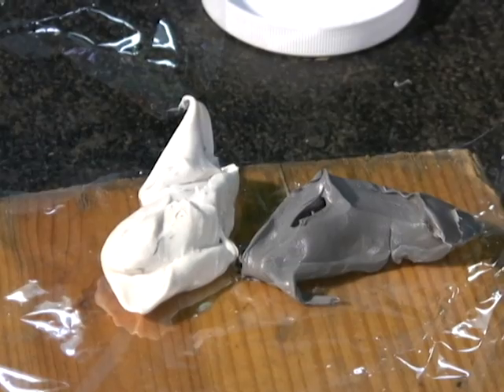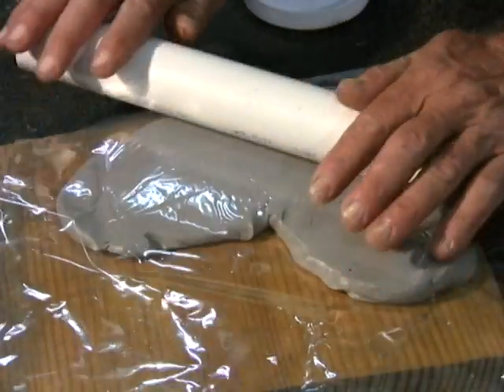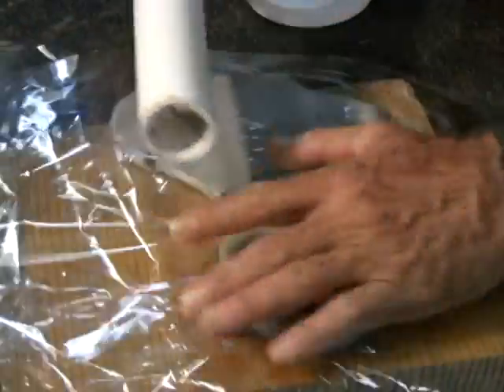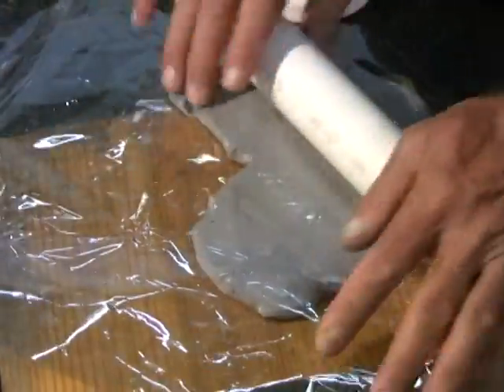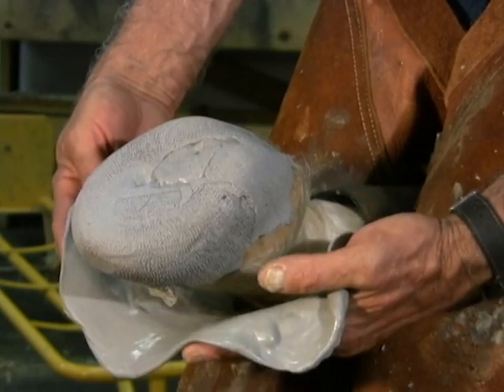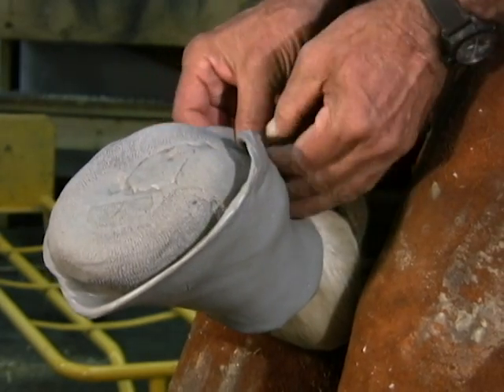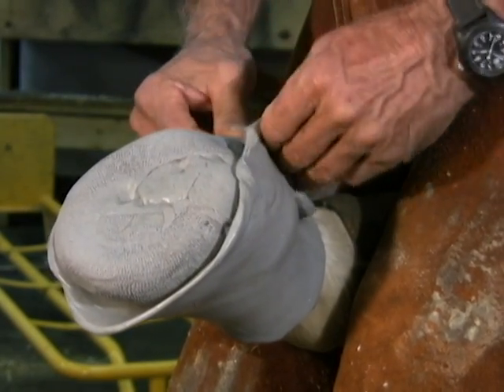Now that we have completed the lower half of the mold, we will mix the ACS in the same manner as we did the lower half, leaving enough unmixed material to patch any holes in the finished product. This time we will roll it out in a banana shape.